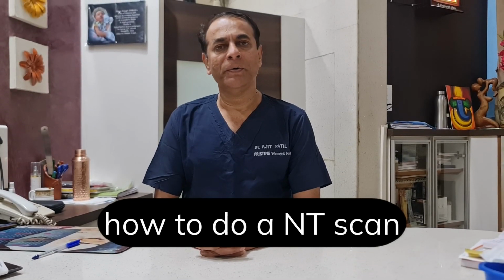Let us see today how an NT scan is performed. Today we know NT scan, which is an integral part of the first trimester assessment of pregnancy at risk, is becoming a universal recommendation, and all pregnant women should be offered first trimester screening during their pregnancy. NT scan is an important part of first trimester screening, and we will see how technically the scan is performed.